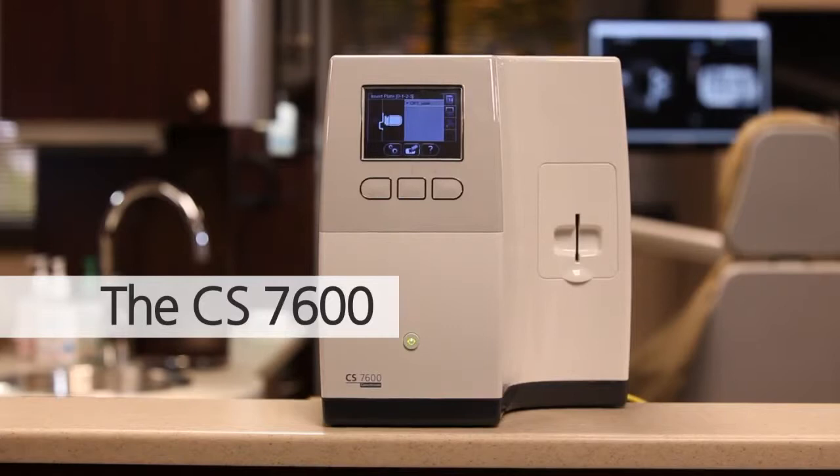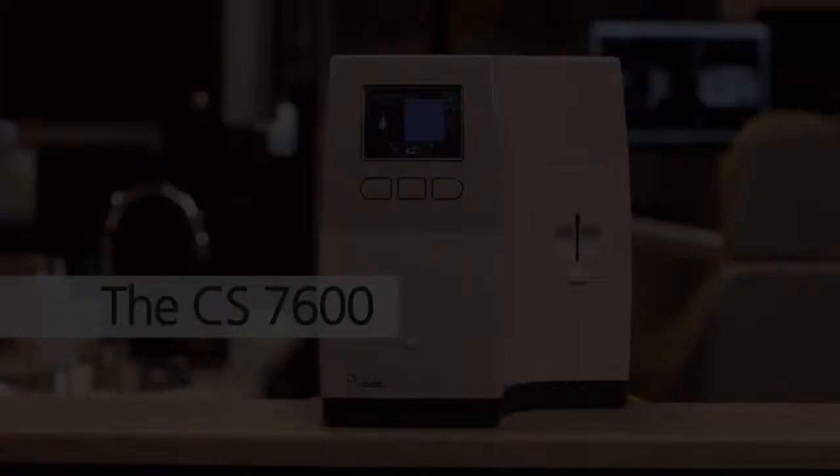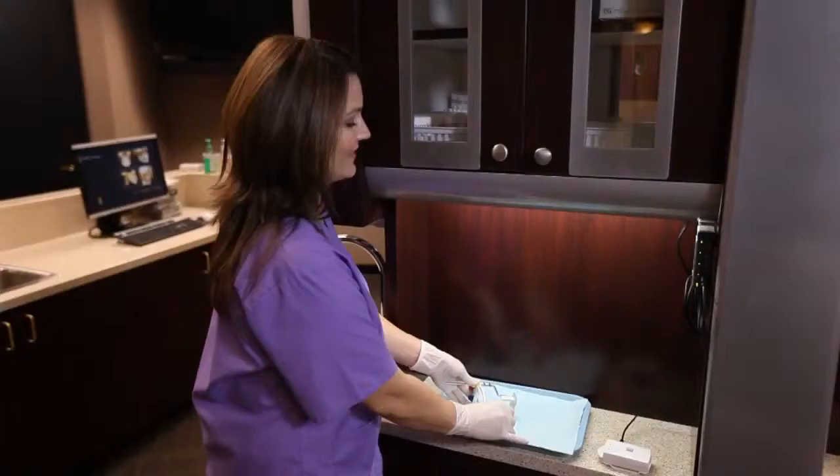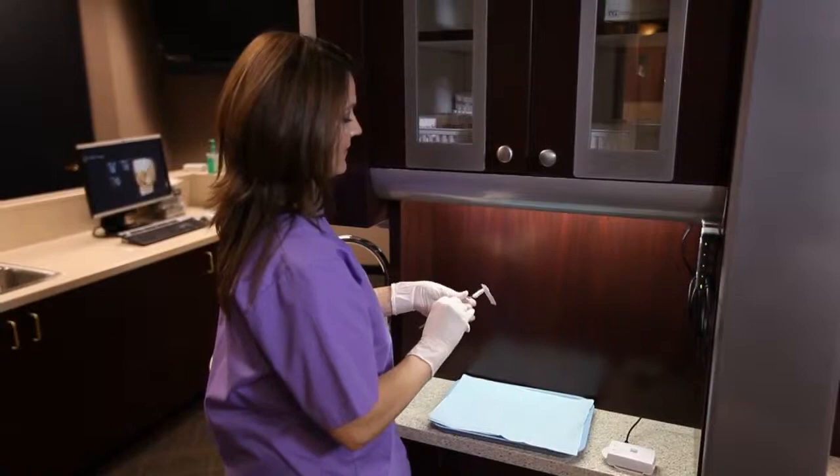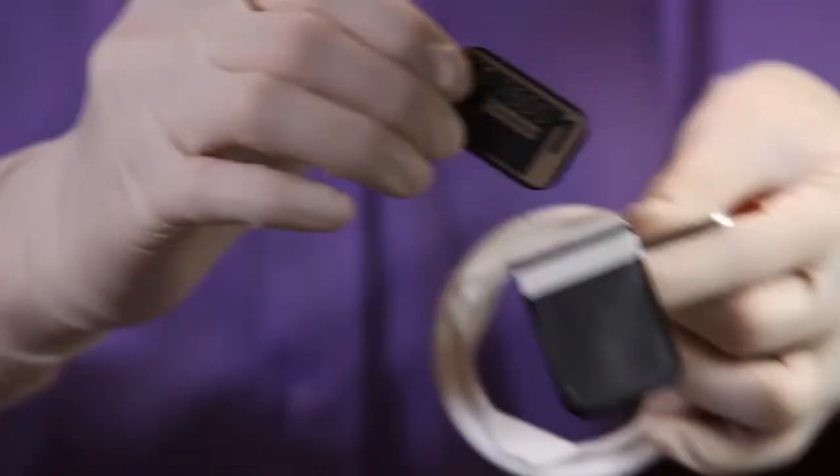The CS7600 offers a truly automated and secured workflow. With exclusive Scan and Go technology, the technician can scan the smart plates to electronically embed them with a patient's pertinent information.